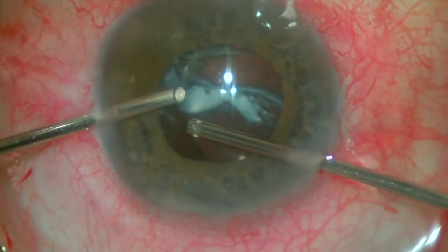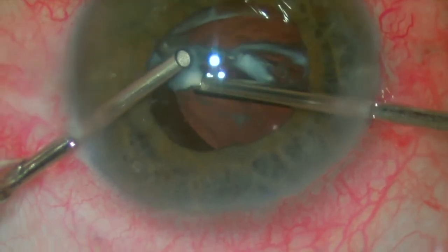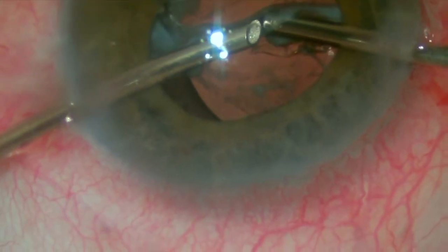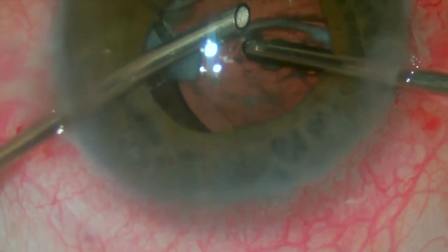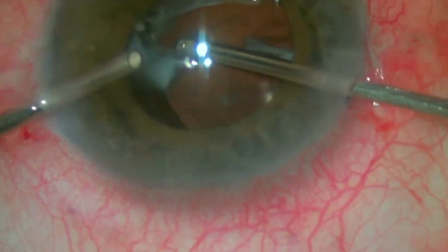Fortunately, there is not much prolapsed vitreous, so we move our attention to the fibrotic cortical material present over the IOL. For dealing with these thick cataract remnants, we like to adjust our settings in the phaco machine to cut IA and use a low cut rate and a high vacuum.